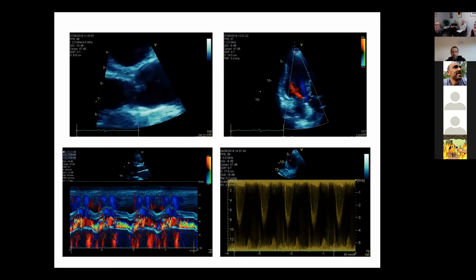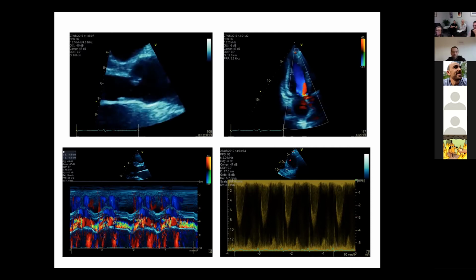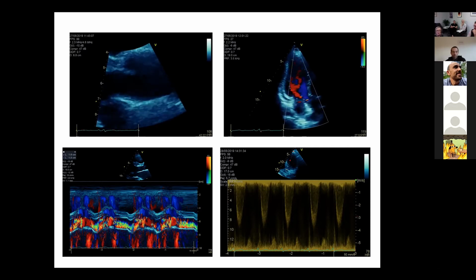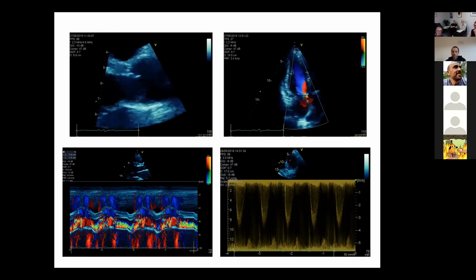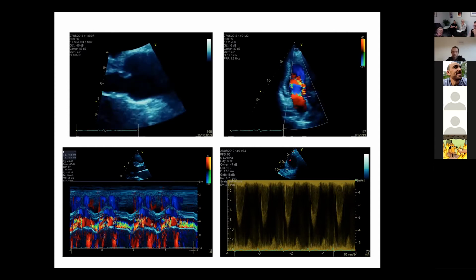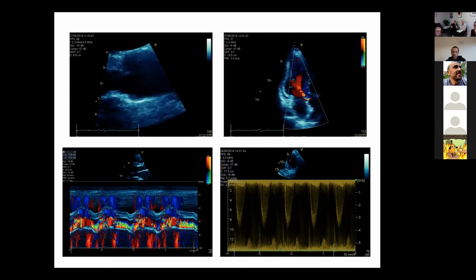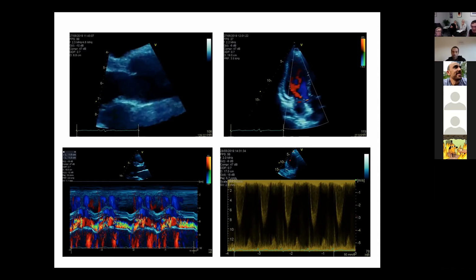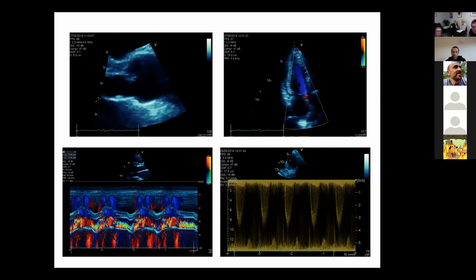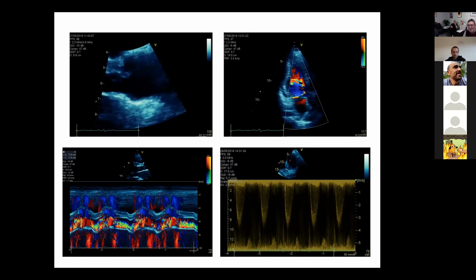Yeah, I worried about that aortic regurg, and I wonder whether the VTI would be high on this signal because of the regurgitant volume that's coming back through, rather than stenosis. It's quite eccentric, and I'd want to look at that in more views to grade the severity. The aortic root looks dilated. I'd be worried about that as a potential mechanism for the regurgitation. And it's greater than 26% there if you looked at the ratio on the M-mode. So we would call that moderate.